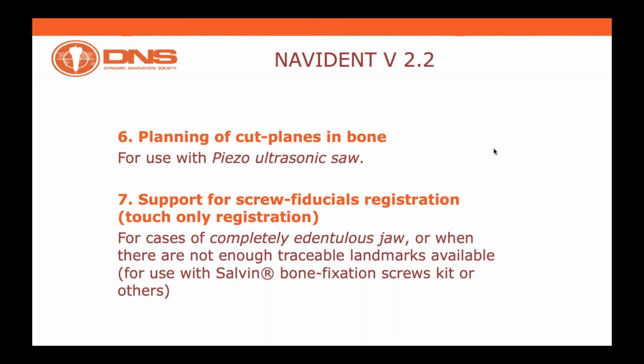Because of the sheer amount of new features, as I mentioned before, we will split this presentation in two, and I will dwell first on the first 5 items, and I will leave the 6th and the 7th item for a second GoToMeeting session.